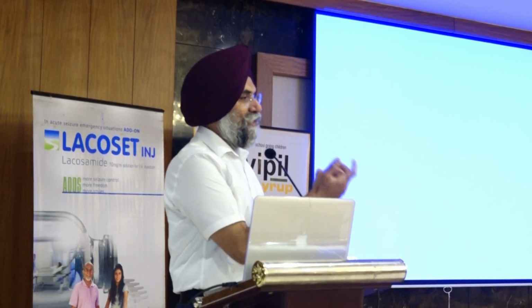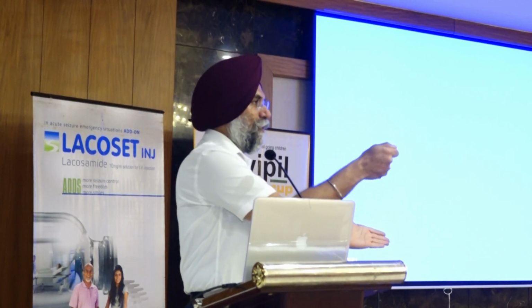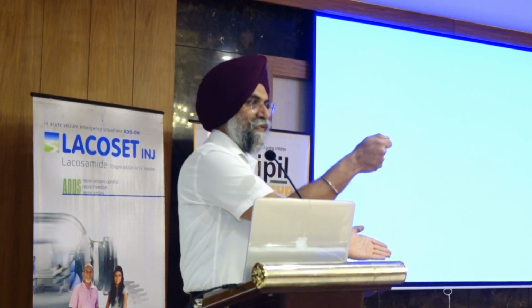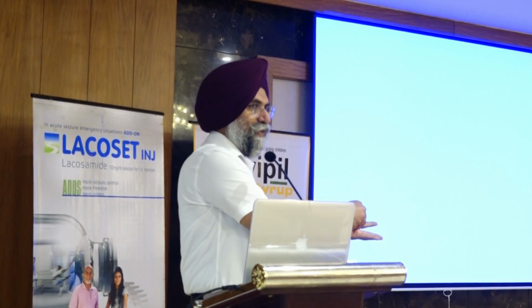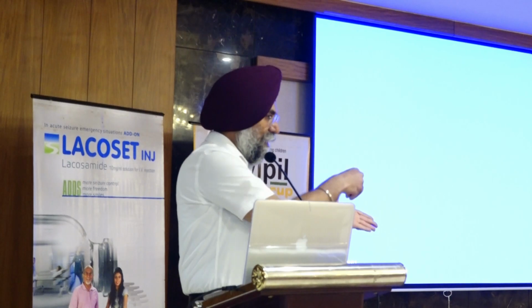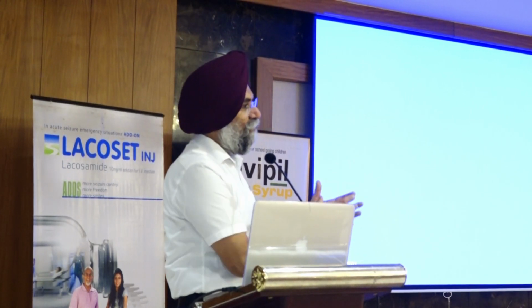Another way of describing it is that we have a paper and a convex lens, and we try to burn the paper in the presence of the sun. We move it up and down until we burn the focus, because we are focusing the sun's radiation into one point of the paper. I think everybody has done it. It is the same function.